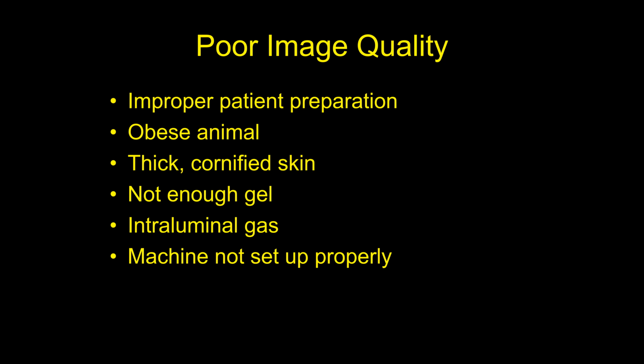You've also probably seen some of these animals that come in and they just have really thick, nasty skin problems, kind of fibrotic skin, really thick skin, stuff like that. Some of the Shar-Peis, no matter how much you clip the Shar-Peis, they don't image very well because they have that weird hair on them, and so they don't image well. Thick skin, not enough gel. Again, don't be afraid to put gel on there.